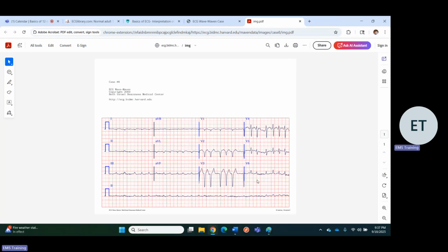There's delayed R wave progression. Can't see any P waves. It's hard to say if there's T-wave abnormalities because the complexes are so small, but I would suspect that there are. It's also tough to appreciate the ST segment, but it doesn't look like there's any disproportionate elevation or depression. But there could be without a closer analysis. I think we've hit the end of this one. I don't know what else to say. It looks like AFib with RVR, a bundle branch block, and poor gain.